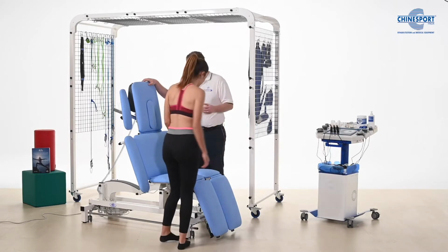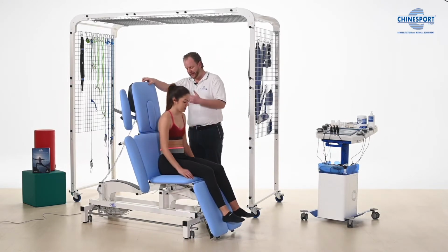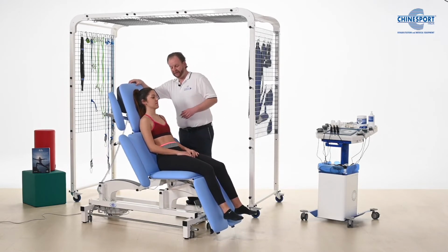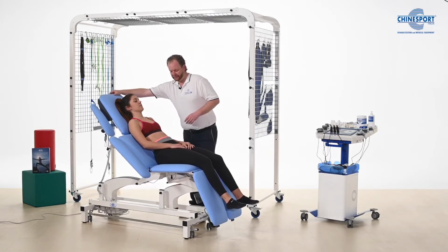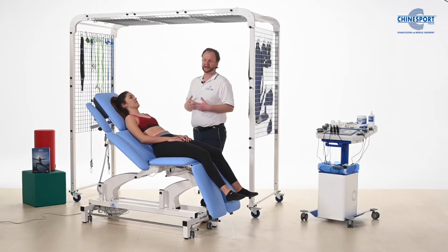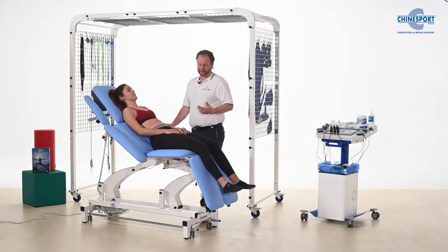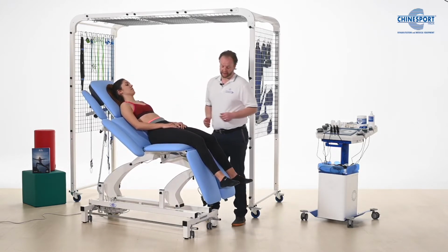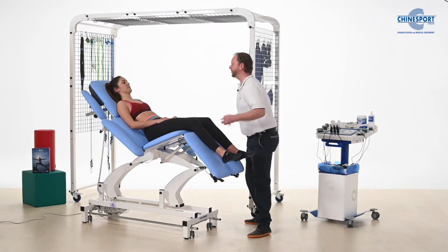Let's imagine that she's got difficulties sitting down and lying down. So it's very easy to put her into a recovery position. And we all know as therapists that it's very difficult sometimes for people to breathe when they have acute low back pain. So it's fine to take a few minutes to explain to your patient also what's going on with their back and explain the pathology.